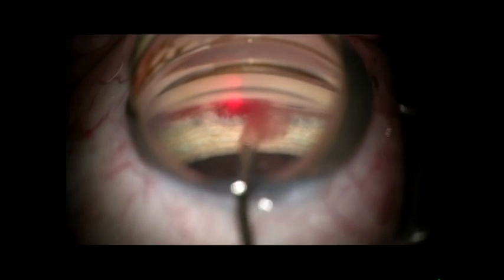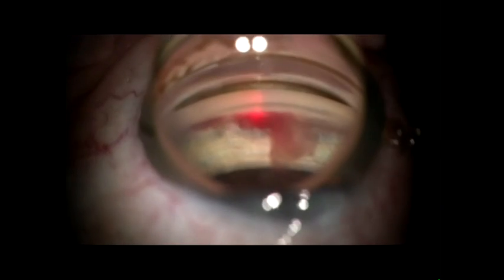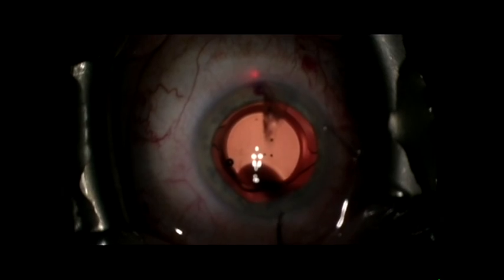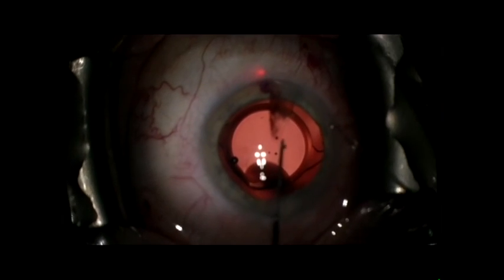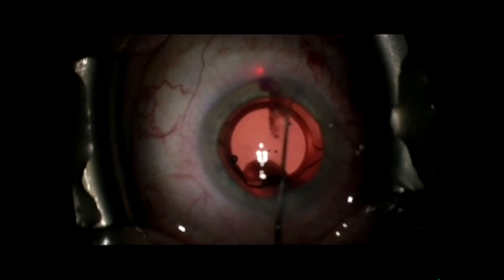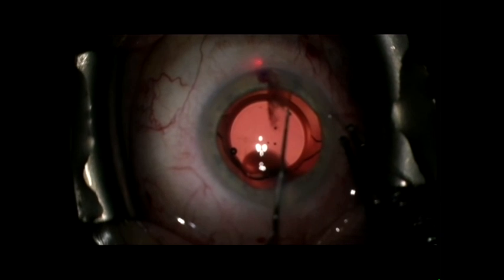It is important that the catheter has been primed before we enter the eye, and also very importantly at this point we want to reprime the catheter with several clicks until we see some Helon oozing from the tip before we begin to pull it back.